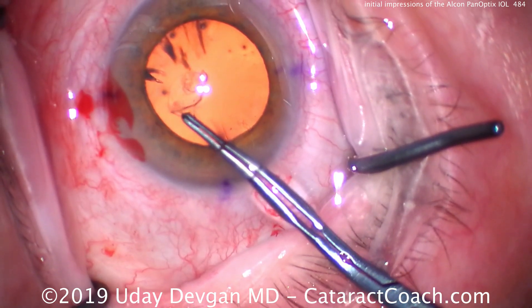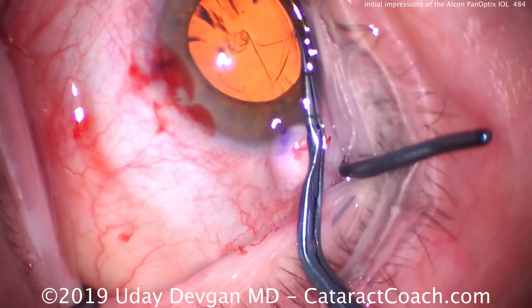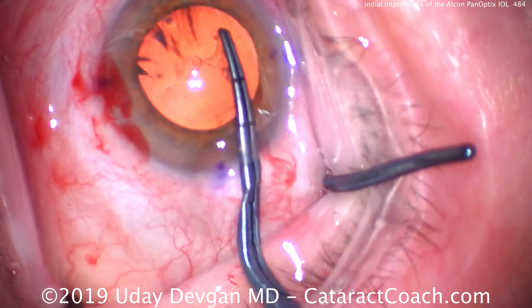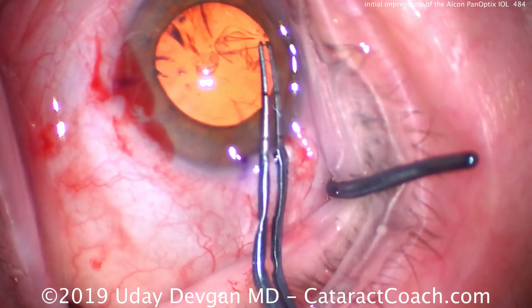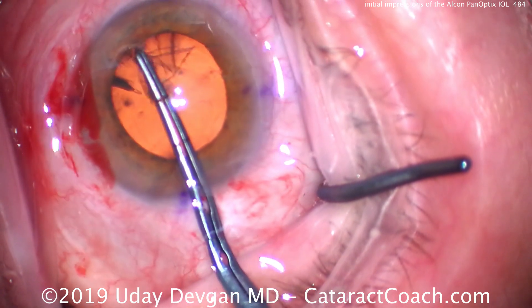It's important to have a good 5 to 5.5 millimeter capsulorrhexis in order to overlap this IOL and hold it in good position, especially with relation to both the toric power at the correct meridian, as well as lining up the central rings of this lens with the patient's visual axis.